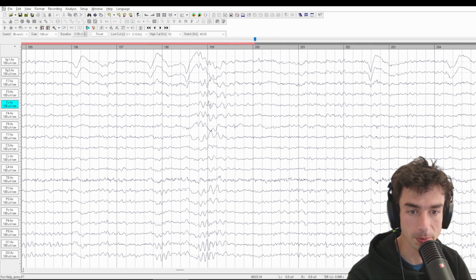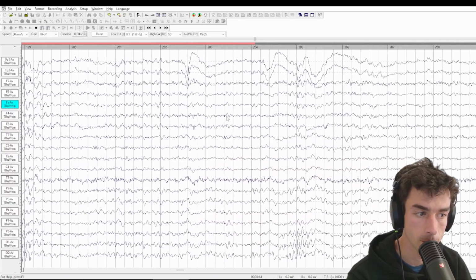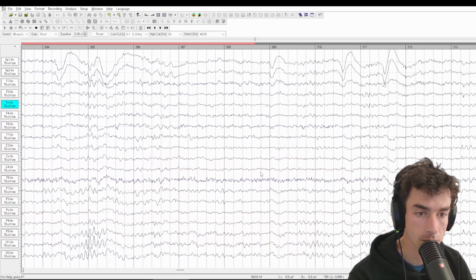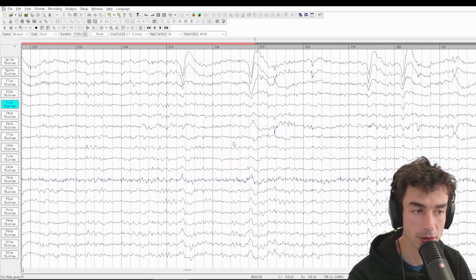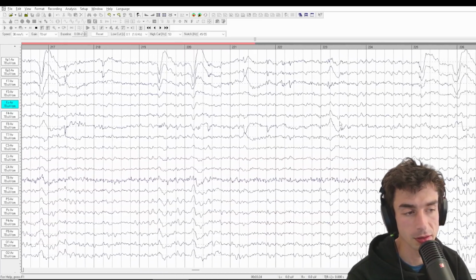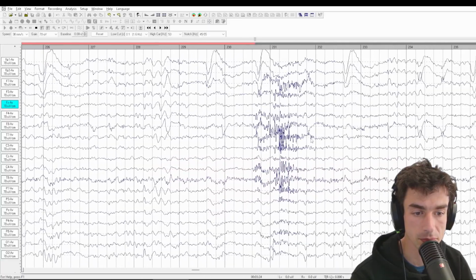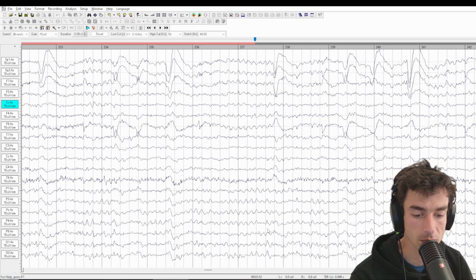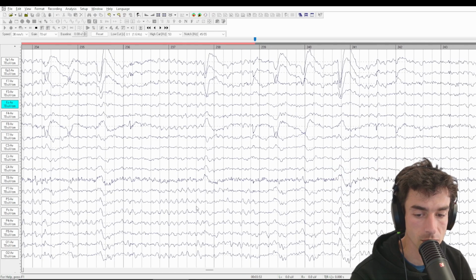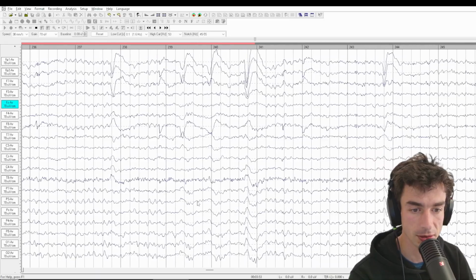Eye blink followed by frontal theta. And a pretty significant dropout again. So real difficulty in maintaining state of vigilance here. Muscle tension. Return of the alpha. It looks like it's about 10 hertz here.